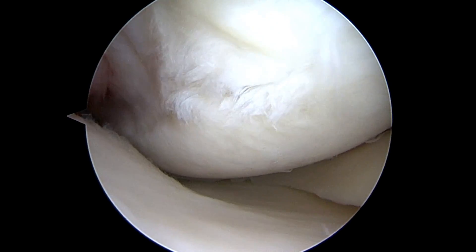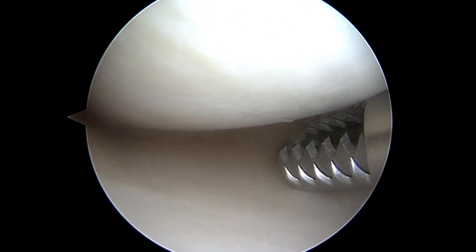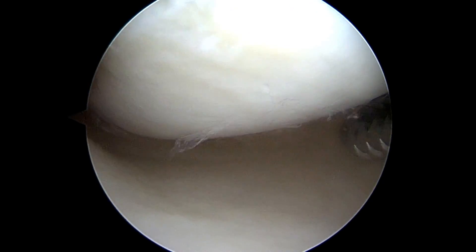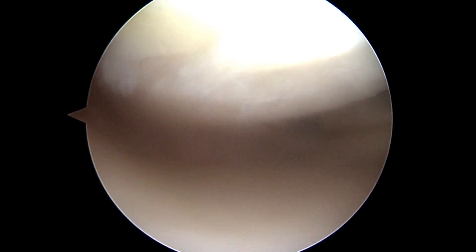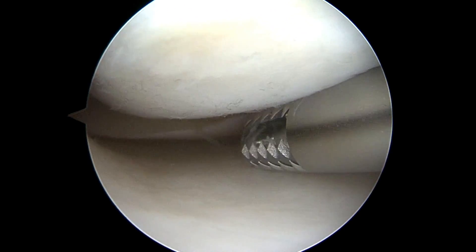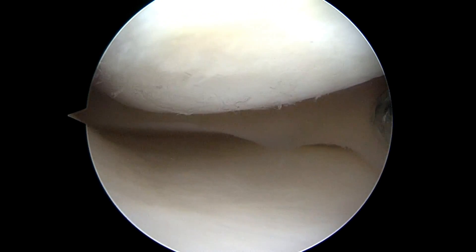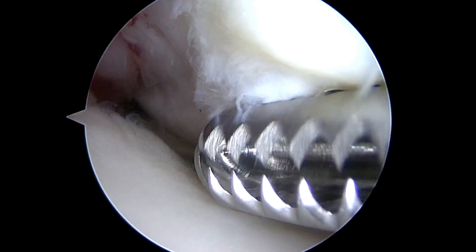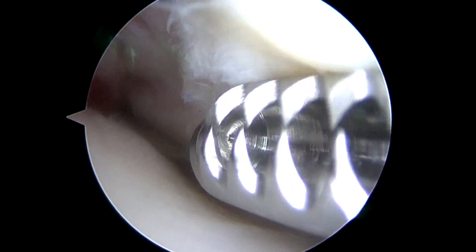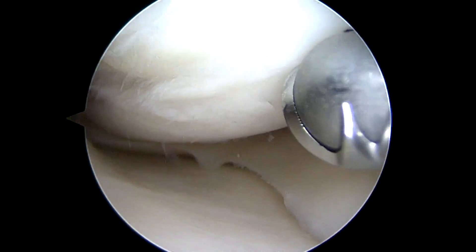Now we're going to start our evaluation of the knee. This is the medial compartment. As we open up the medial compartment to have a look, so far so good. I don't see any significant injury to the meniscus as we just flush a bunch of saltwater through. As we look at the condyle, you can see some roughening here, kind of on the lateral aspect of the medial femoral condyle, but nothing grossly loose.